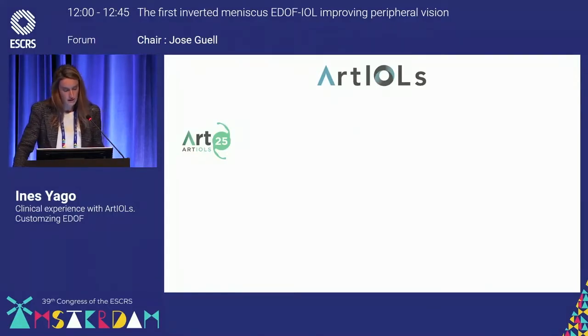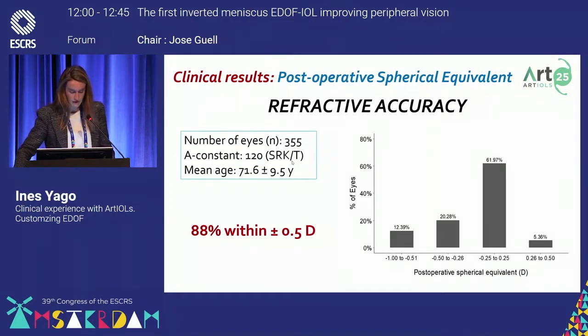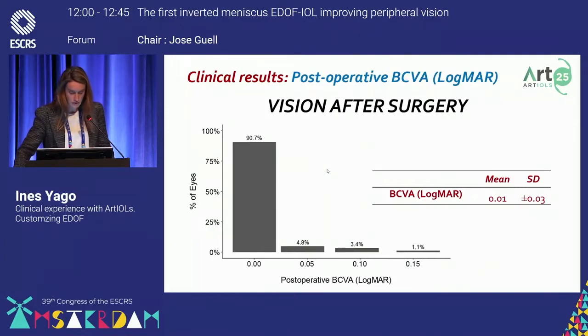First of all, I would like to present the results in terms of safety and efficacy with the ArtIOL 25, as it's the largest group we have implanted. We have 355 eyes implanted with this model, and as you can see, the refractive results are good, with a post-op spherical equivalent of -0.18, with up to 90% of patients within half a diopter of residual refraction, with most of them within 0.25, and over 90% of patients achieve 0 logMAR in best-corrected distance visual acuity, as you can see here.